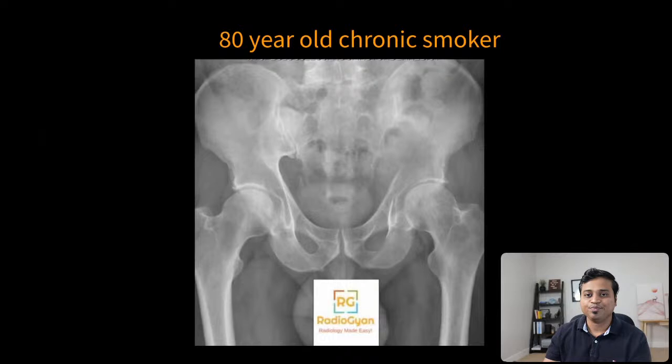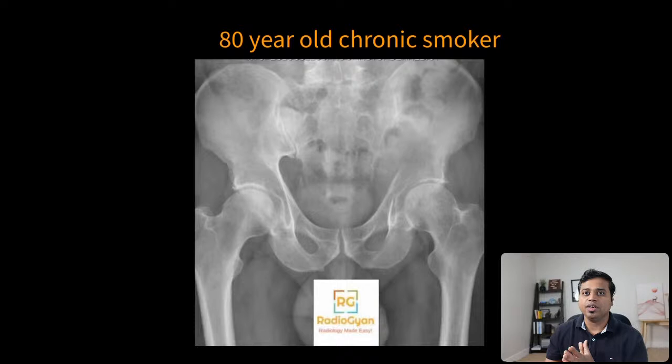Again, a very challenging case on radiograph. The history helps, but let's first try to localize the tumor. Does it involve the right innominate bone, the left innominate bone, or the femurs? Let me know in the chat.